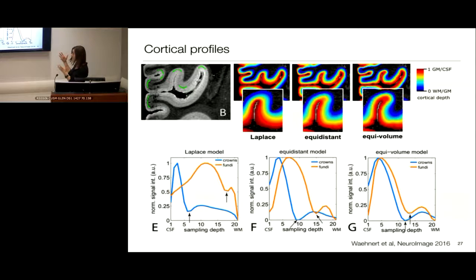So far we've validated this using post-mortem MRI, with beautiful resolution. This was 75 micrometers isotropic, scanned at 7T for a very long time. Is it worth it in vivo?